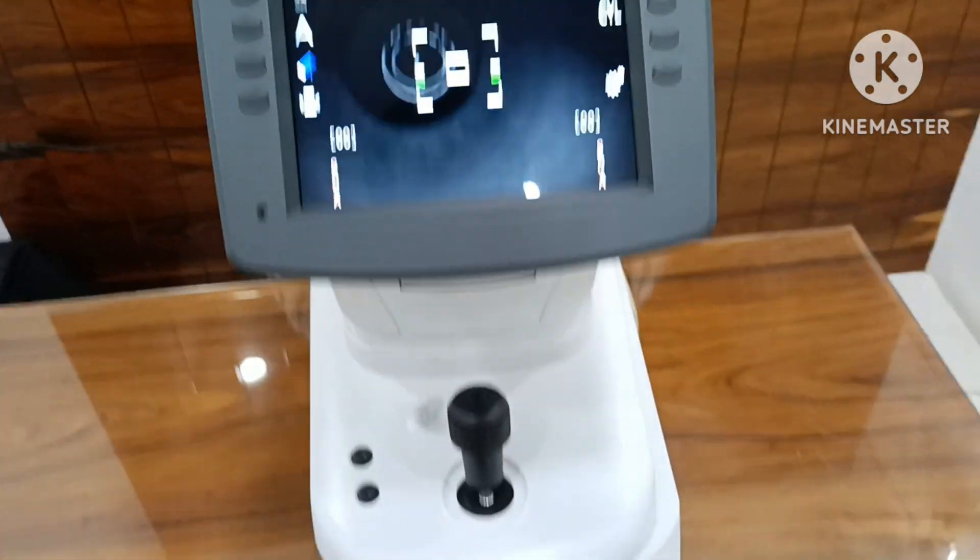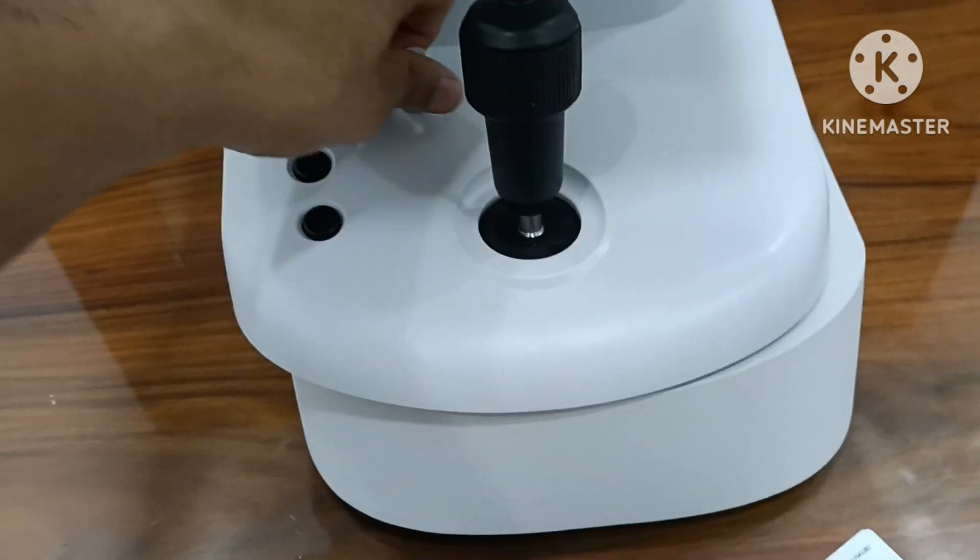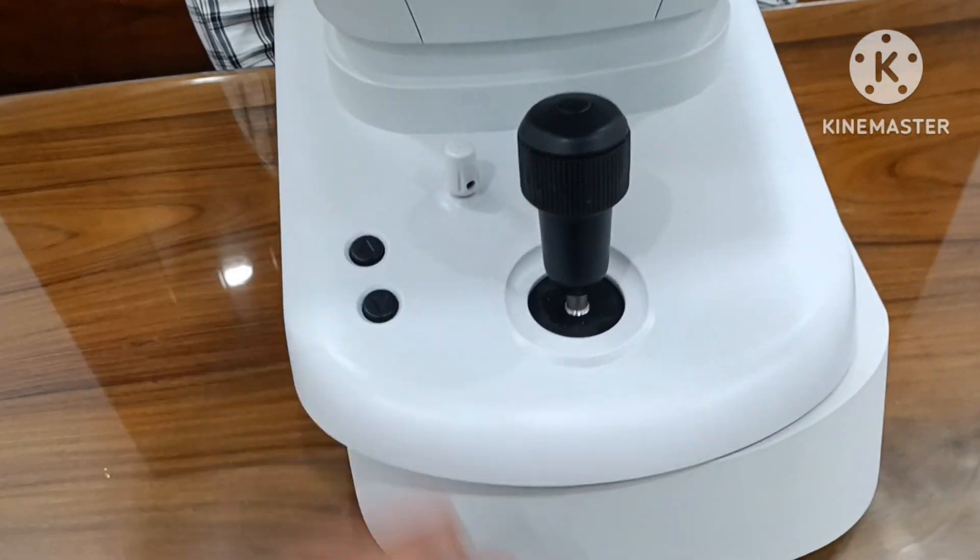Autoref manual mode available. Two locks available: basic and main lock.